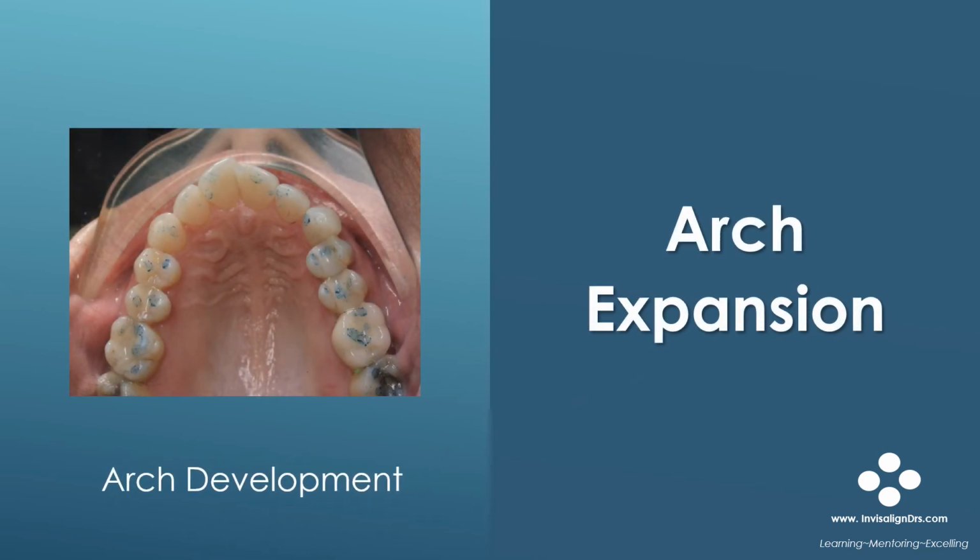Expansion is often needed to develop the dental arches. Narrower arches need to be expanded. This will create arch space. There are limits, though, in cases with inadequate periodontal support. You will need to use your discretion in deciding if you're going to perform this expansion. The next series of slides will cover expansion.